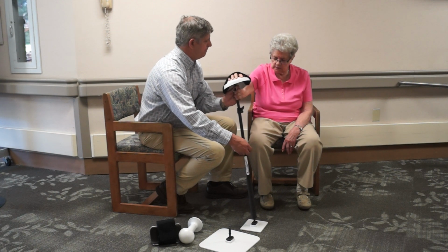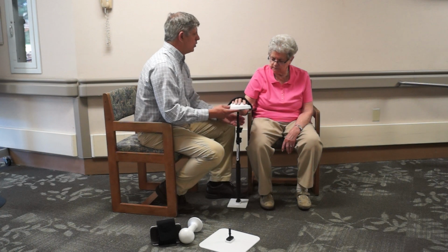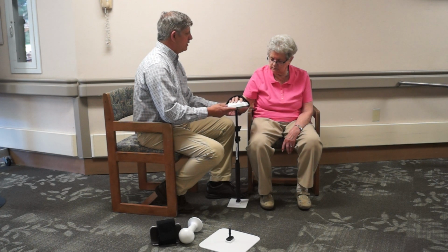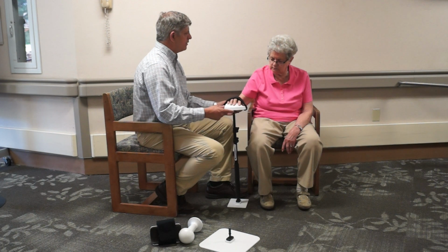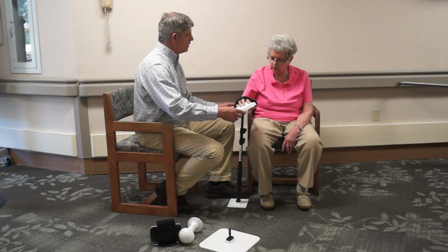I'll bring you down. And then let's just do a cool down again. And just do a few low ones, just like you're sliding across the table, okay? Think of reaching for the objects when you're eating, okay?